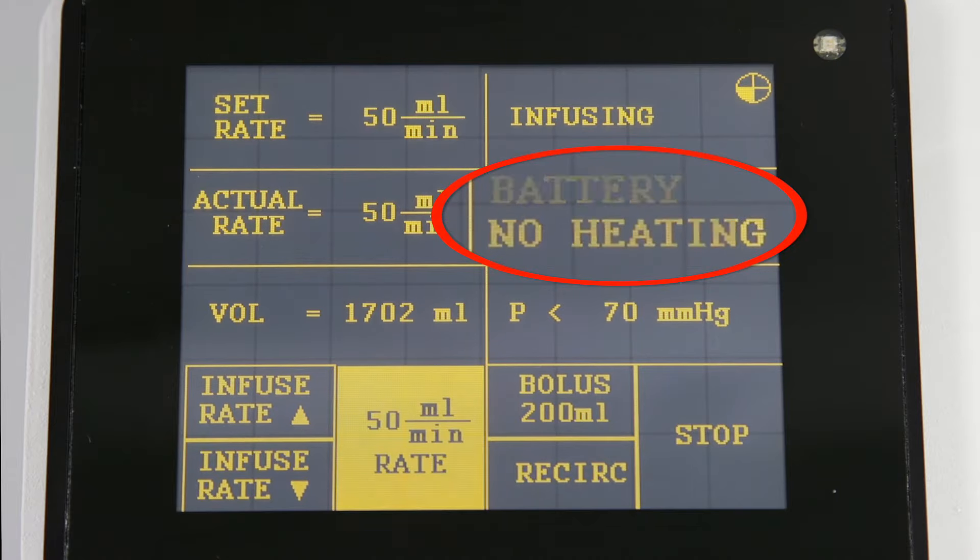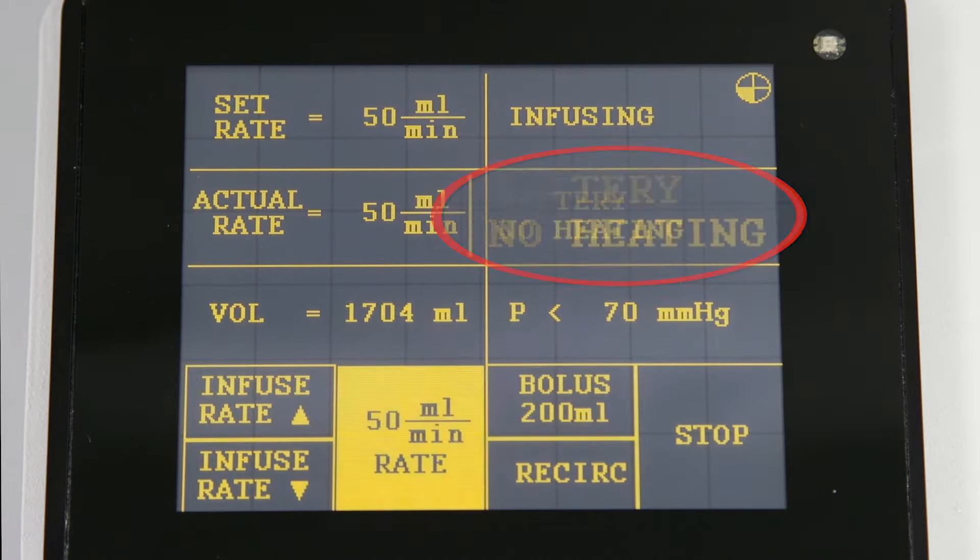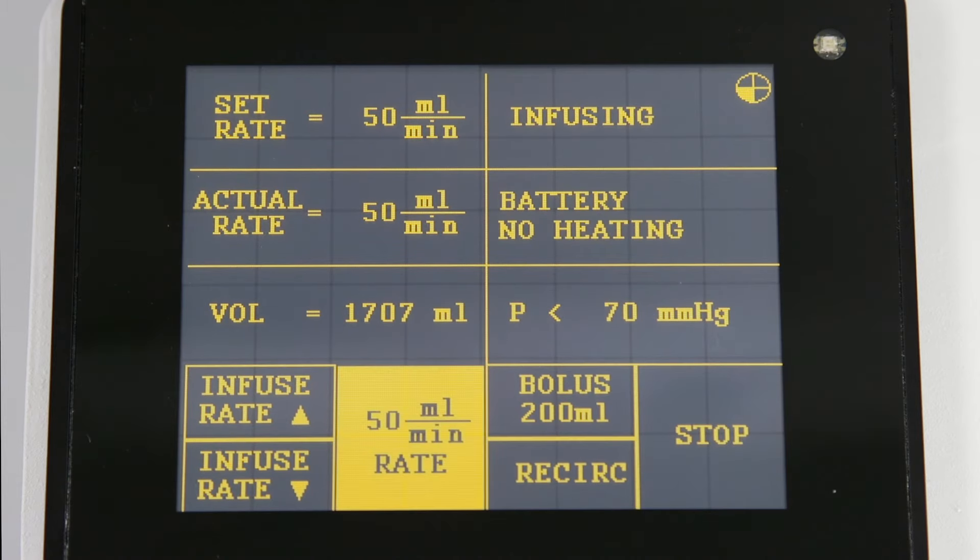There is no fluid heating when the device is on battery power. To protect the patient from rapid infusion of cold fluids, the flow rate is limited to a maximum of 50 milliliters per minute.